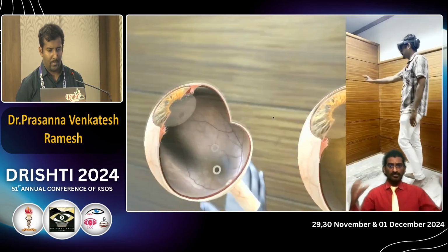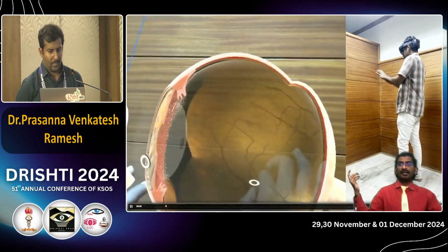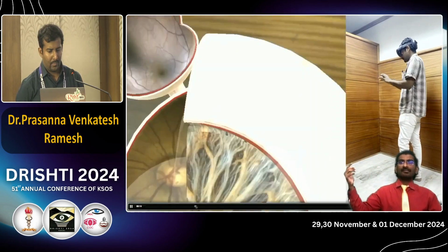So moving on to the 4D, with the portable simulator that you connect, you can see I am wearing it, and then I can not only teach but also examine the patient's case sheet.